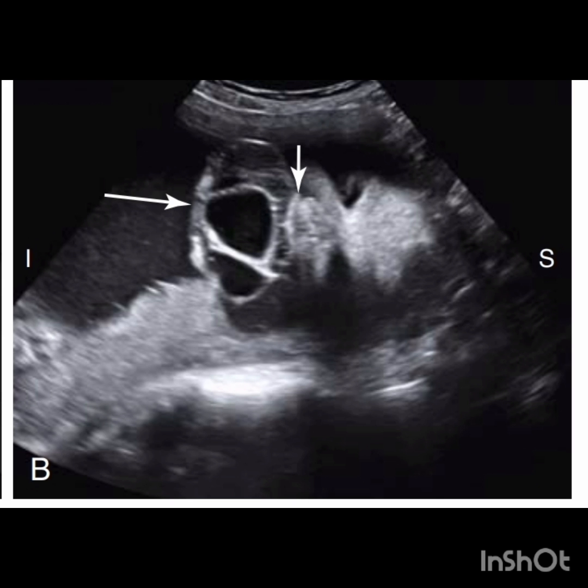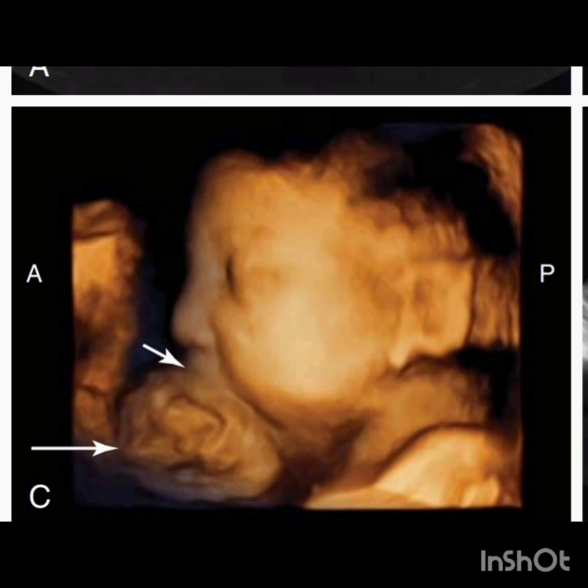This is the coronal image of the same fetus showing the encephalocele herniating through the mouth. This is also followed by a three-dimensional surface rendered image of the same fetus with the encephalocele herniating through the mouth.